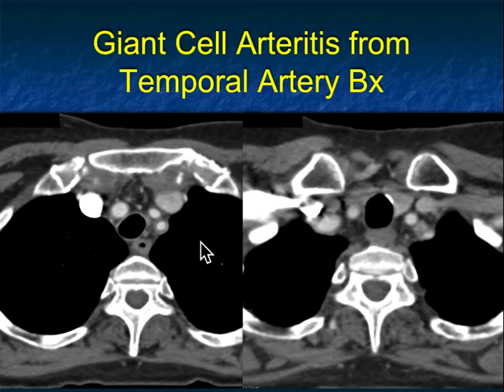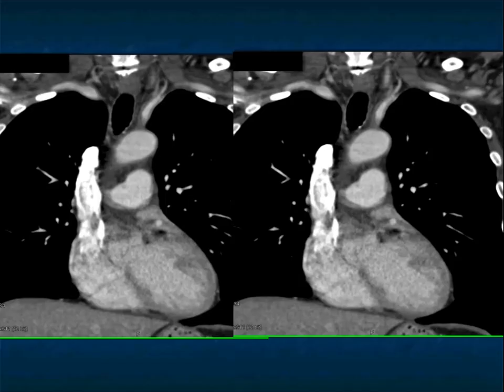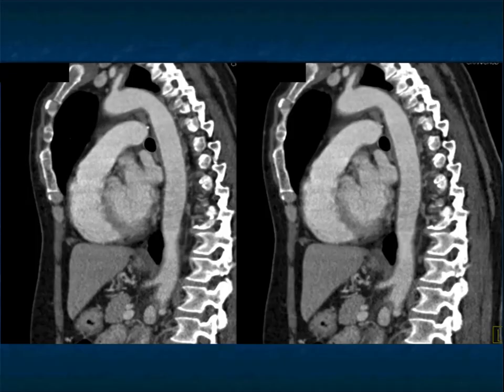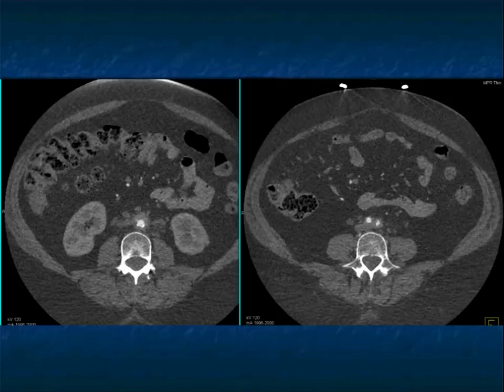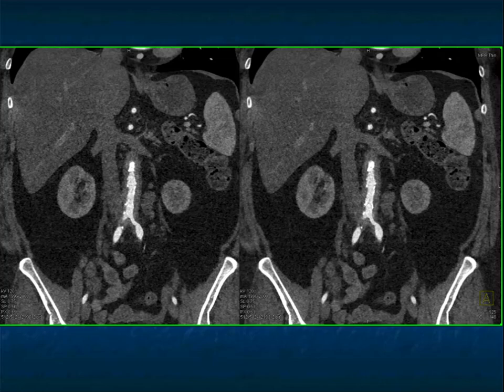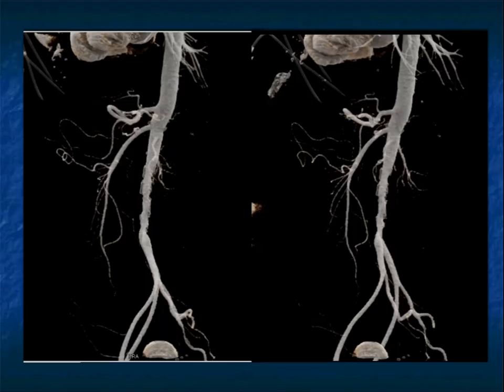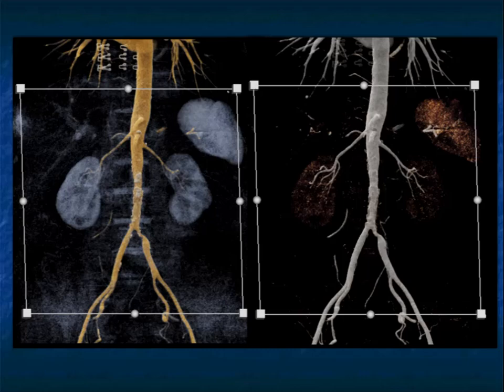Here's a nice case of giant cell arteritis. You can see the thickening of the innominate and the thickening of the subclavian artery, which you really appreciate on the coronal view — the left subclavian with extensive thickening and narrowing. Here it is again from a sagittal view, showing the thickening and narrowing very nicely. Another example shows soft tissue thickening of the abdominal aorta tracking downward, involving the common iliac arteries, and on 3D volume rendering you can see the narrowing of the aorta down to the bifurcation from this giant cell arteritis.